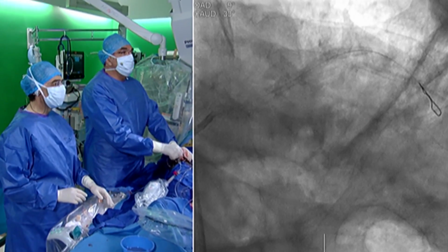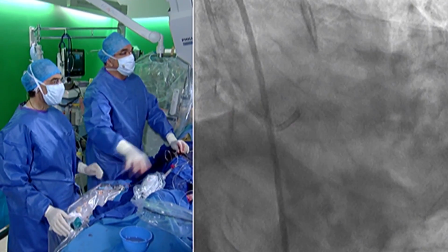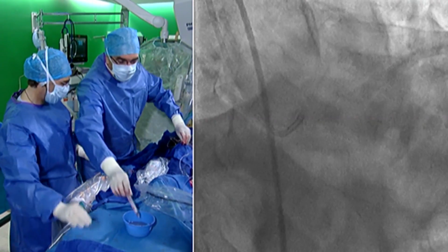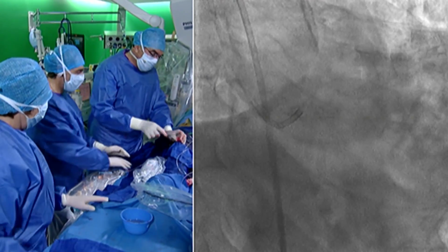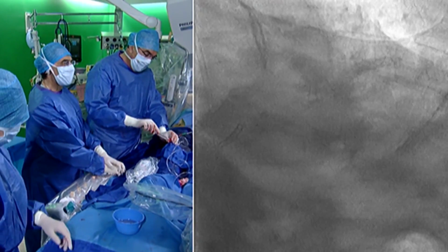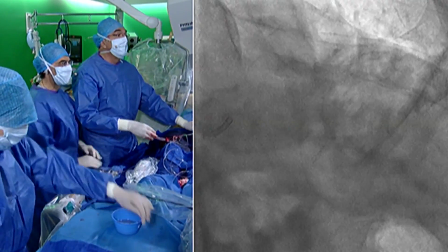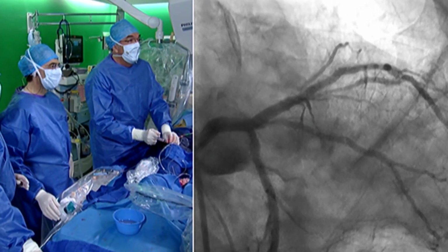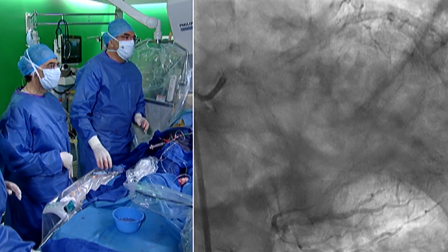Okay, so what we can do now is to remove, and because I know that we have to leave you, the line of the satellite will be closed in a few minutes, a few seconds. So I will give you this final result.